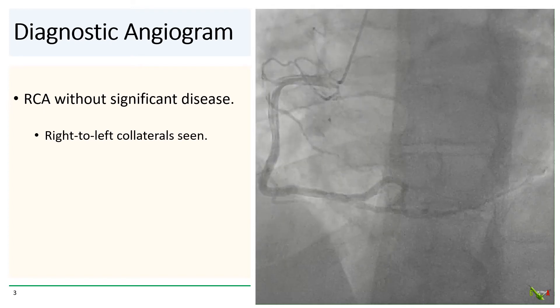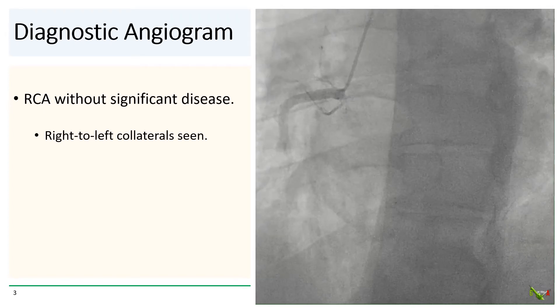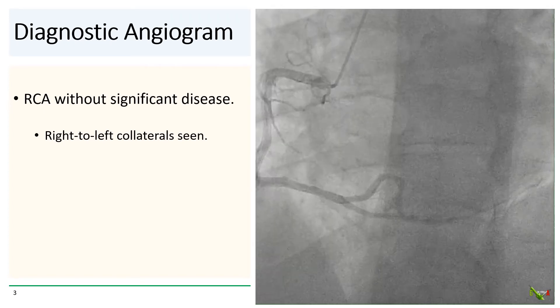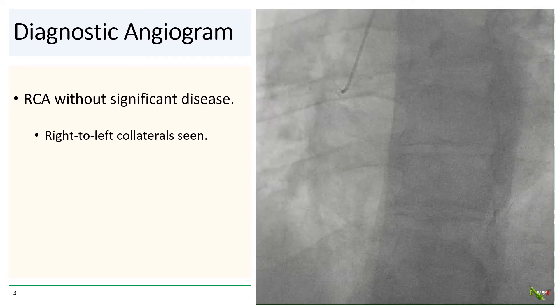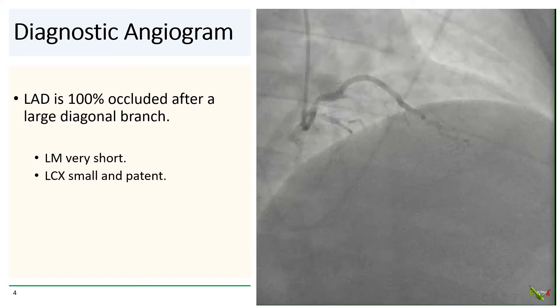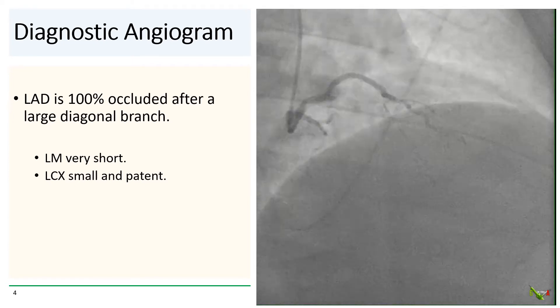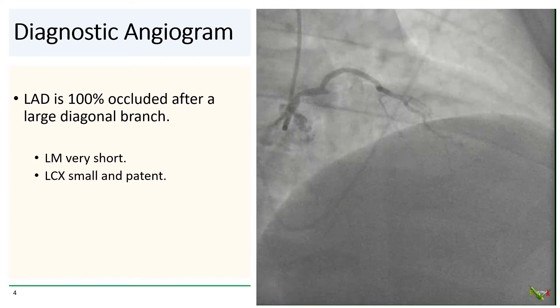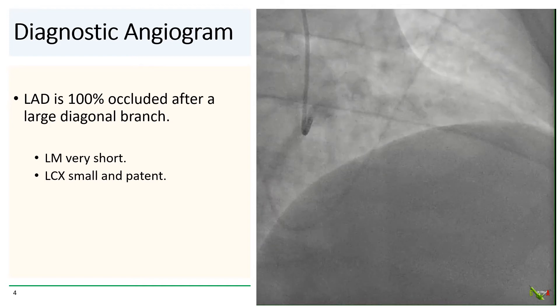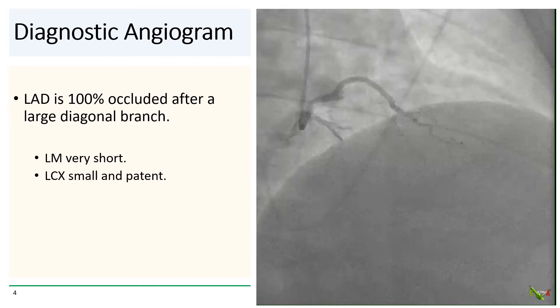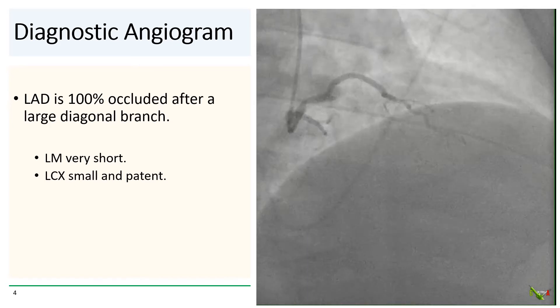On diagnostic angiogram, the RCA was without significant disease, but you can see some right to left collaterals. The culprit is the LAD, which is 100% occluded after the large diagonal branch. The left main is quite short, and you can see a hint of the circumflex, which is small but patent.